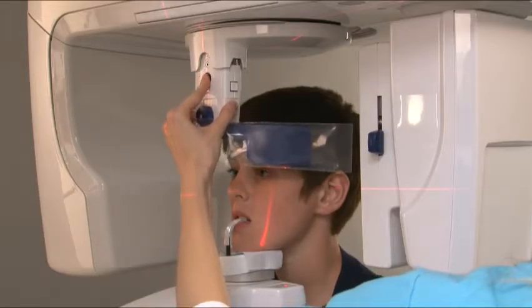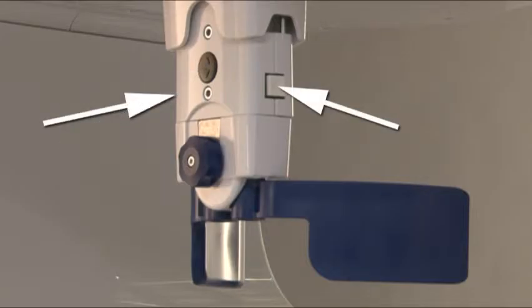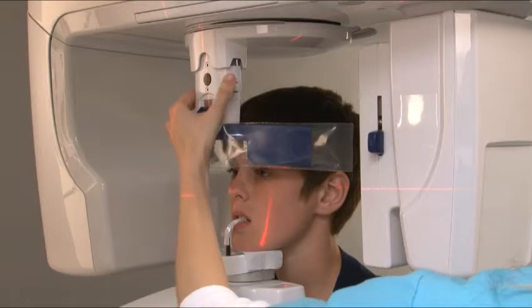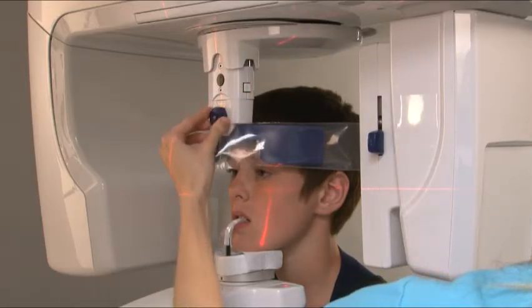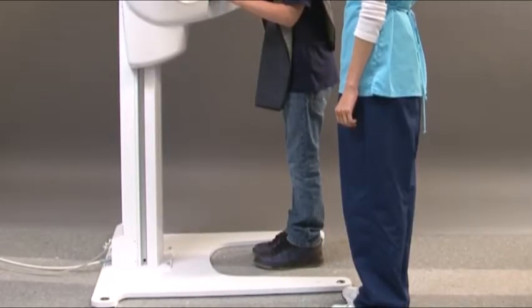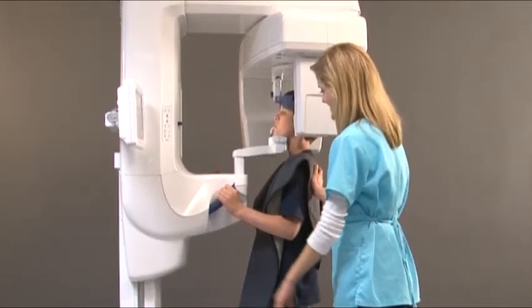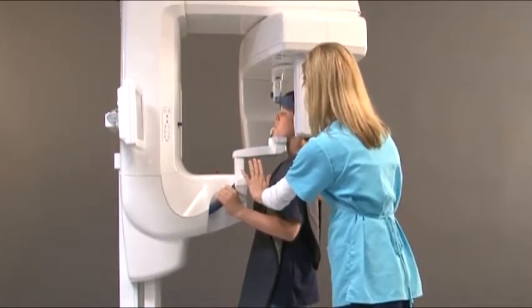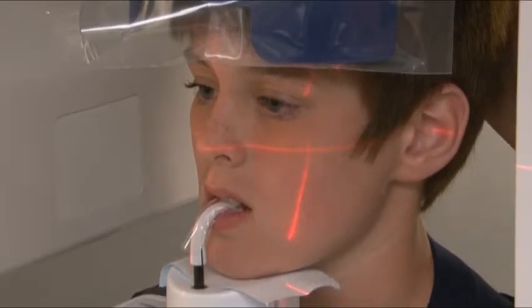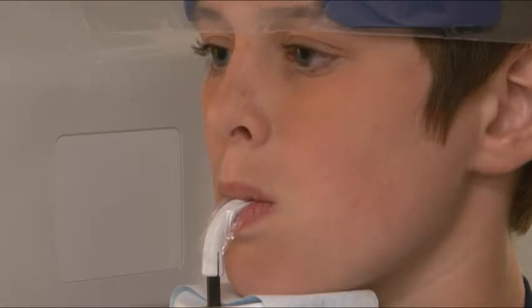Carefully push the head support towards the patient. Pressing the black button on the head support allows up and down movement; pressing both white buttons on the side allows back and forth movement. Rotate the head support knob clockwise to close the temple supports so that they gently but firmly grip the patient's head. Ask the patient to step forward slightly, positioning them out of balance and forcing them to stretch their neck as far as possible. Check that the patient has not moved and is still in the correct position. Ask the patient to press their lips together and press their tongue against the roof of their mouth.